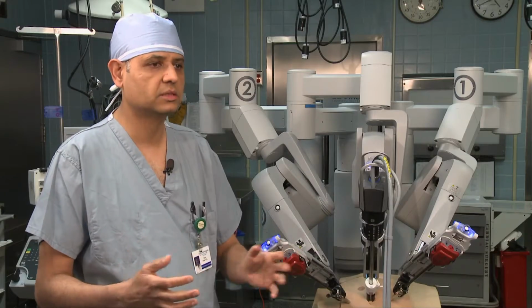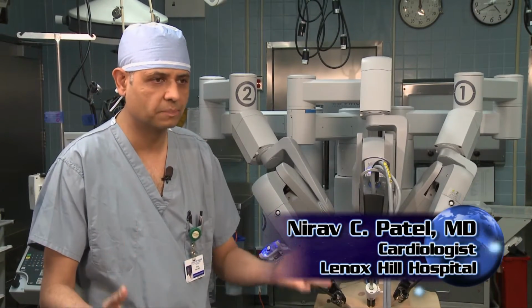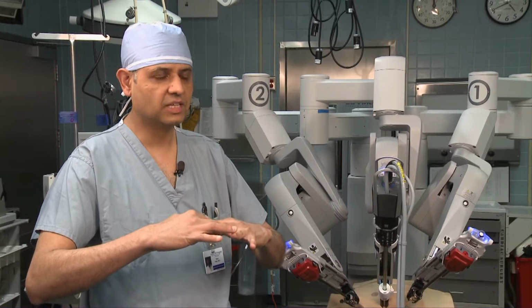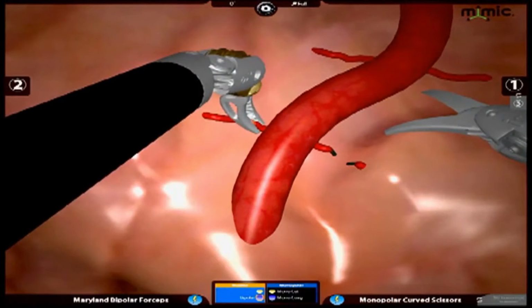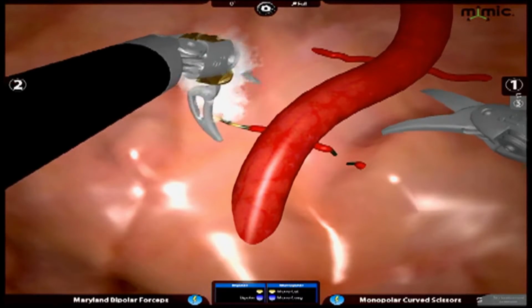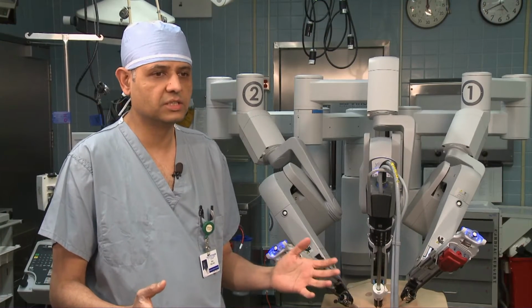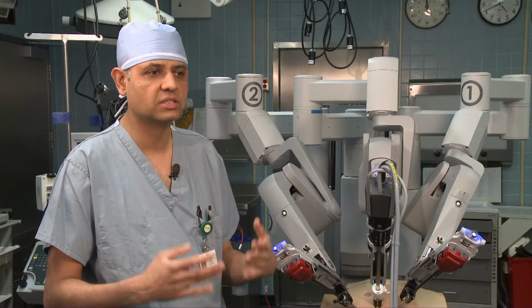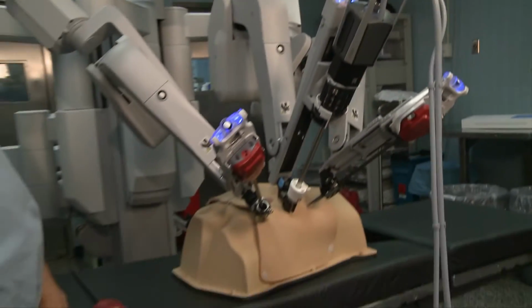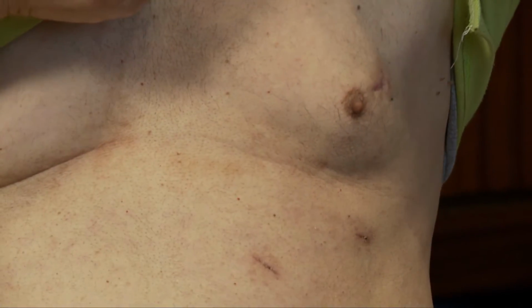So about 10, 12 years ago, the surgeons realized that maybe we don't have to stop the heart. We can stop the surface of the heart, so the rest of the heart can move, but we can freeze that particular surface of the heart, open the artery, and still continue to do precise suturing. So beating heart surgery for bypass surgery is an established procedure. The smaller incisions resulting from robotic procedures result in much less bleeding and much shorter recovery time for the patient.